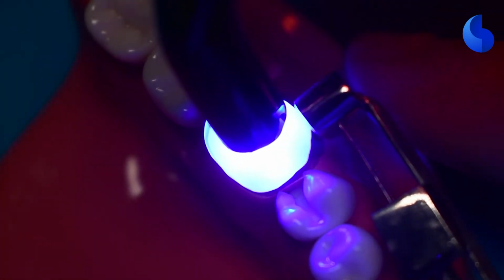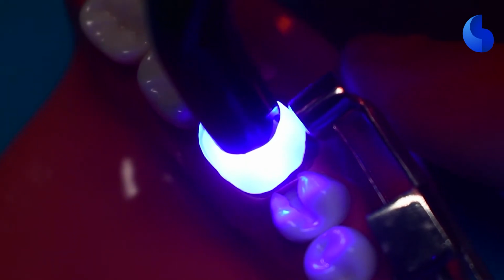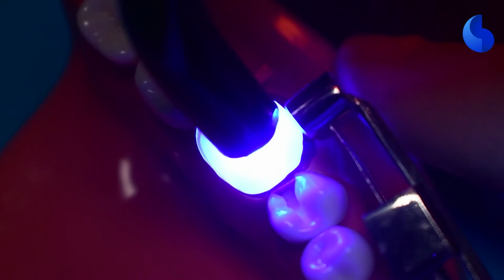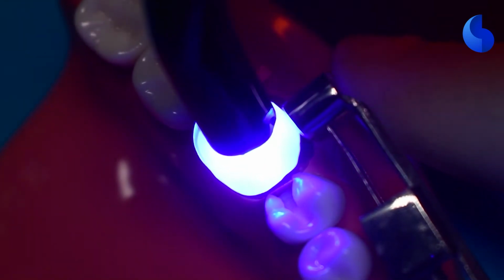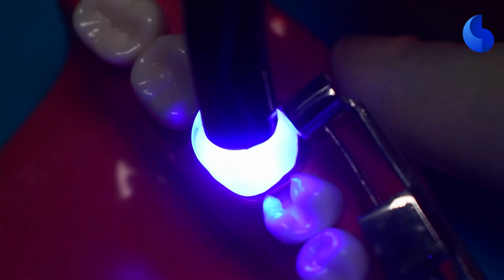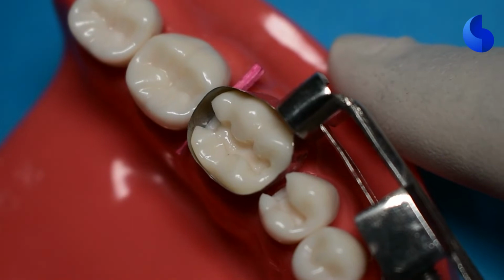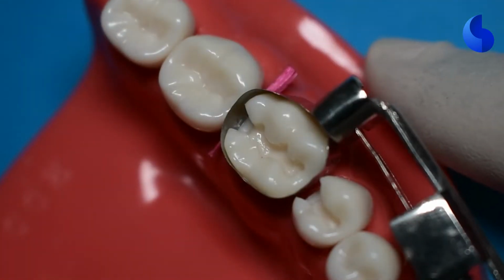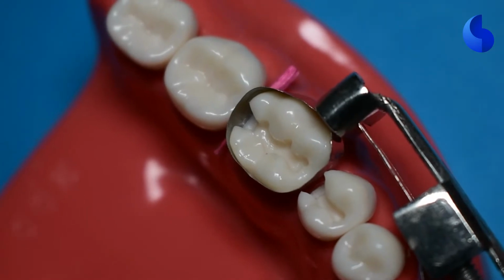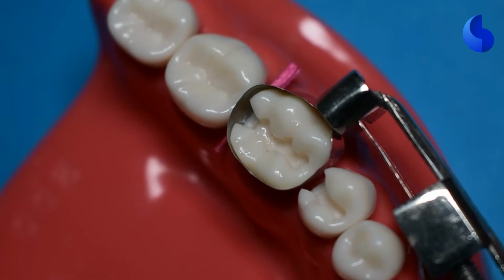And you'll see that we also used bonding agent, even though it's a plastic tooth. This is because the bonding agent helps to close the voids that sometimes your restorative material may not reach. And it also gives you a little bit of adhesion. You don't want your restorative material to come out when the examiner is trying to evaluate your restoration. So now that you've placed some bonding agent, make sure you blow some air on it and then cure it. We're ready to restore this tooth.